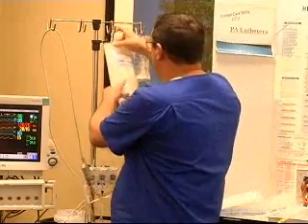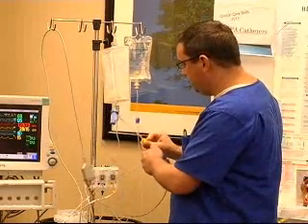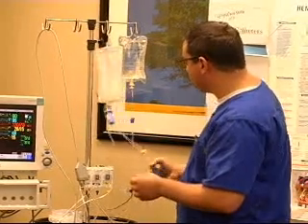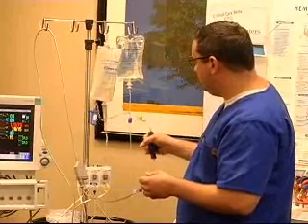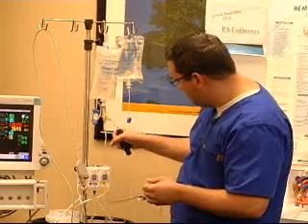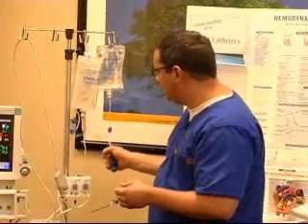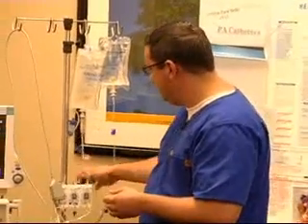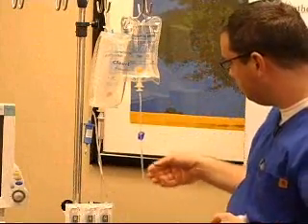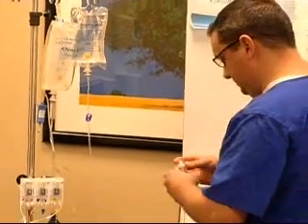And this will go up to the little green zone on here, and that's about 300. So now your cardiac output bag does not need a pressure bag, and I actually saw one like that set up one time. I guess it didn't hurt anything per se, but I don't know the purpose behind it. So anyway, make sure you've got this set up and it's on your 300 and you got your pressure ready, all part of your initial setup. You've got your cardiac output syringe ready. We're going to connect that up.